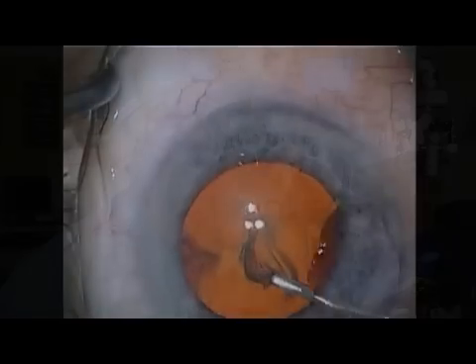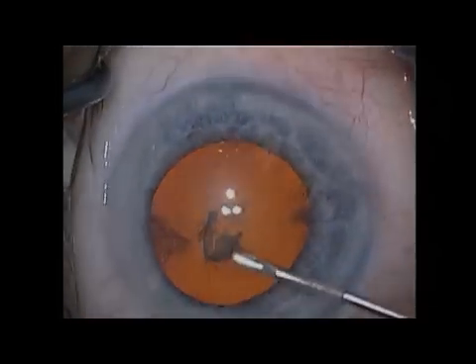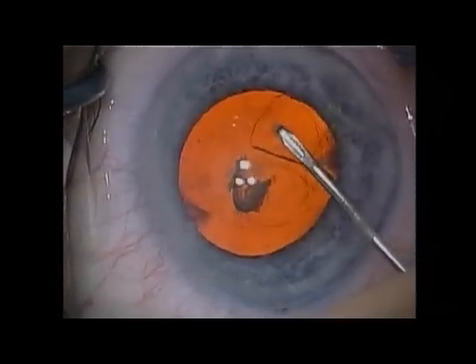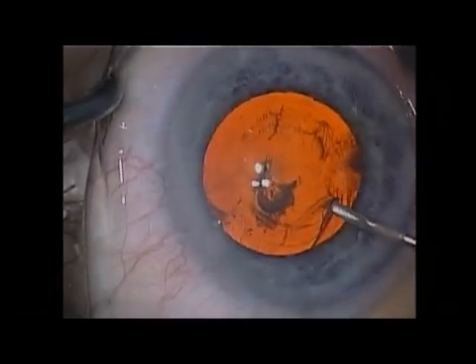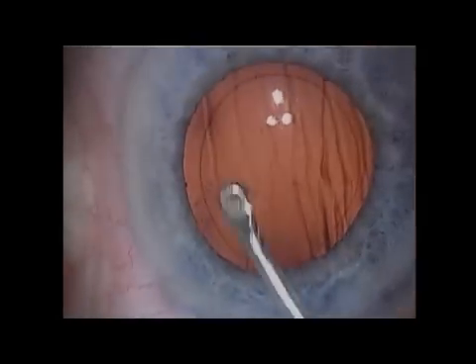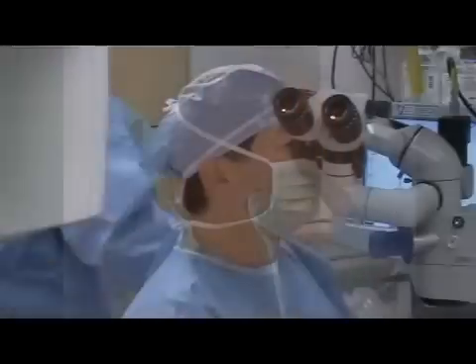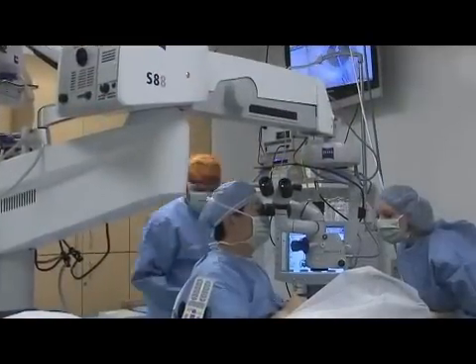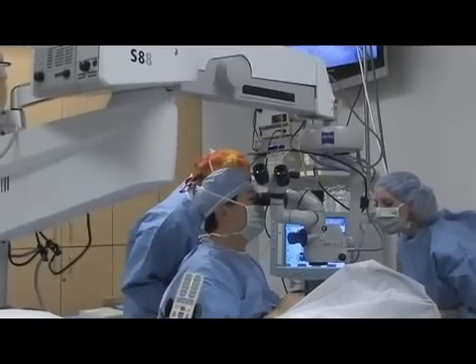What's really amazing about the view with Lumera is the details of the capsule. We've all been doing capsulorrhexis over and over again, but when you start seeing the details of the little folds as the capsule is torn, the little perforations, you're seeing it at a different level. Anything where you're looking at the capsule — polishing the posterior capsule, looking at the zonules, making your capsulorrhexis — you're going to actually see details that you just didn't see before.